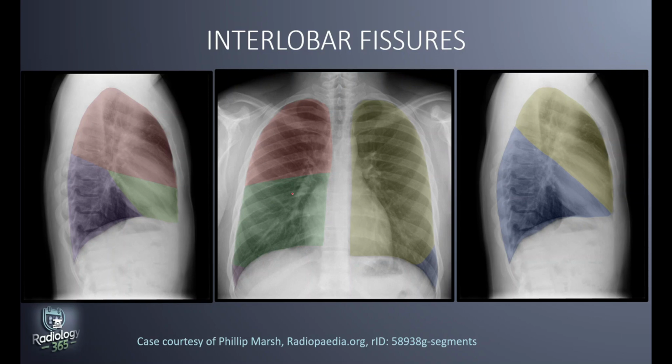And so on x-rays, it's better to use zonal anatomy, upper zone, middle zone, and lower zone, as opposed to saying with your chest x-ray that there's a lesion or something in the upper lobe or the lower lobe. Of course, you would have to apply certain other techniques to differentiate middle lobe from upper lobe and lower lobe lesions. All right.